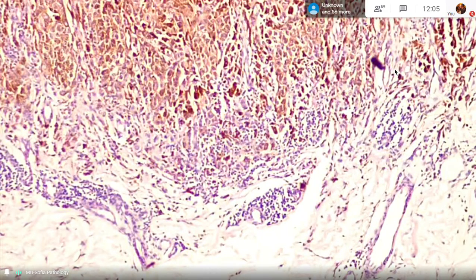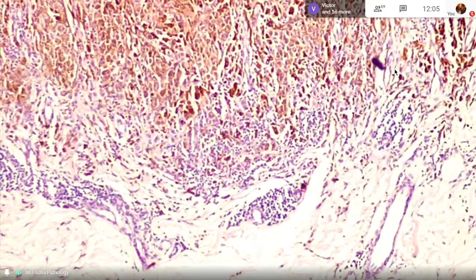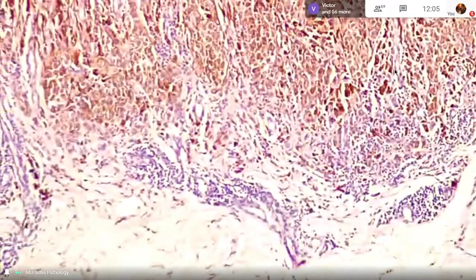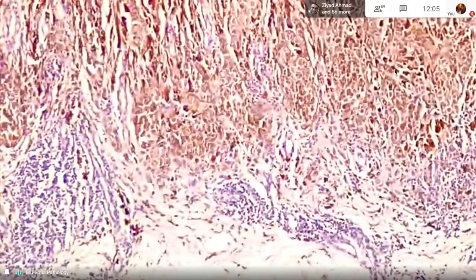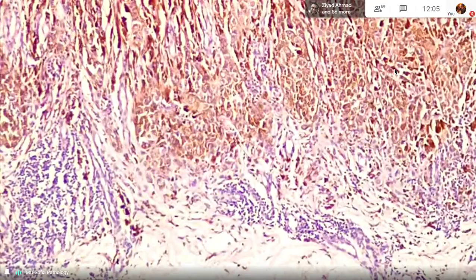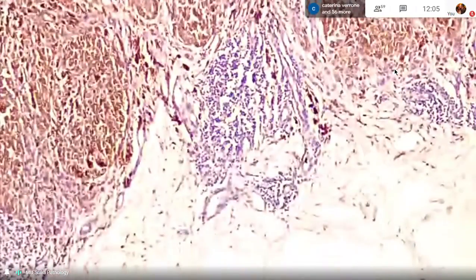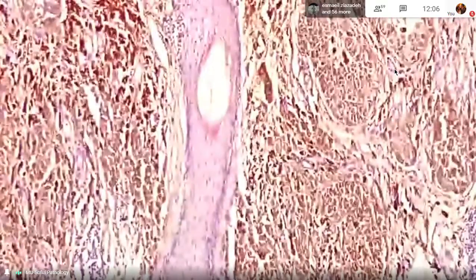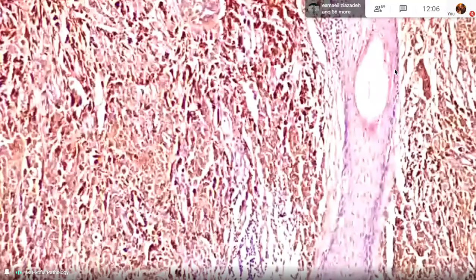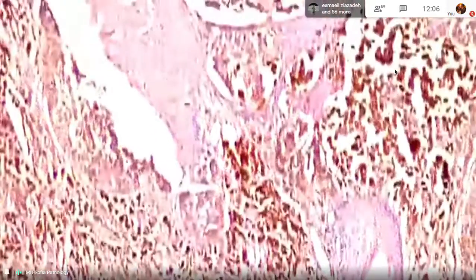So it is important. And of course, you can see that there is already invasion within the blood vessels. There is a lymphovascular invasion, even in this slide. And there can be perineural invasion with satellite nodules. In-transit metastasis is the term that we use for this malignant melanoma.